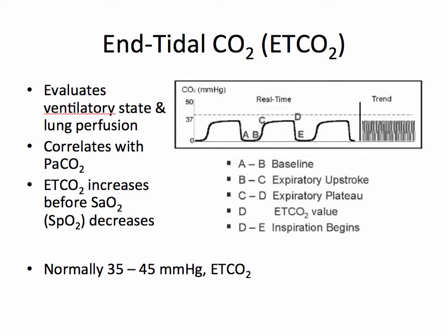The second form of monitoring end-tidal CO2 is by waveform. This evaluates the ventilatory state and lung perfusion, and correlates well with the PaCO2. End-tidal CO2 will increase before the SaO2, or oxygen saturation, decreases. Normally, the end-tidal CO2 ranges from 35 to 45, just like a normal PaCO2.